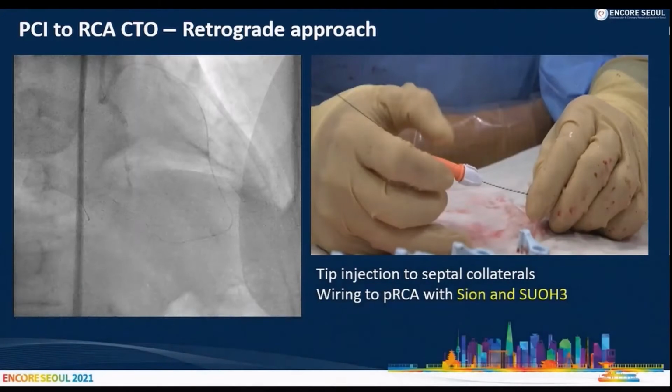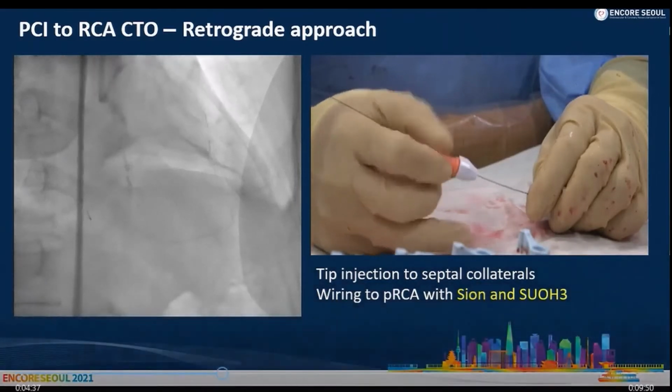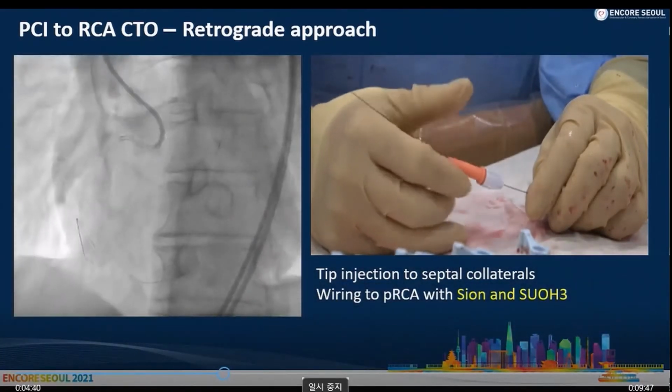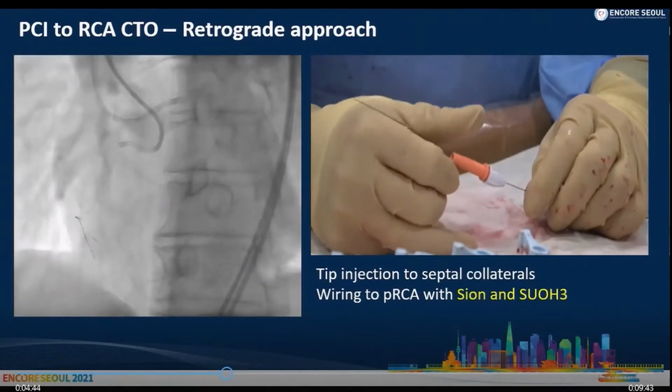Junior is always pushing the wire. Waiting may erase the frictional force and spasm of the corkscrew channel. Yeah, very nice technique. Minimizing the frictional force is a very important tip to navigate the corkscrew channel.